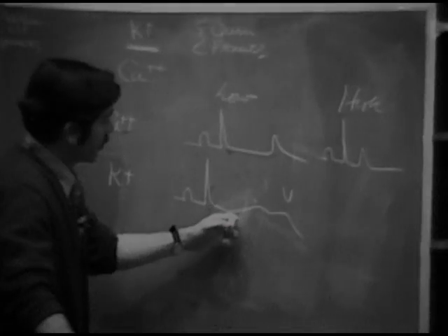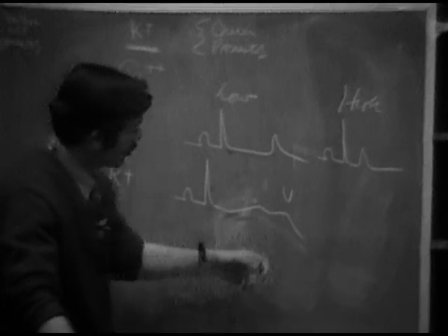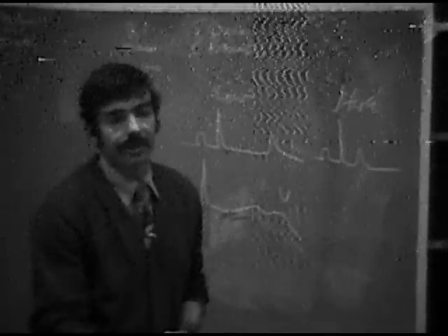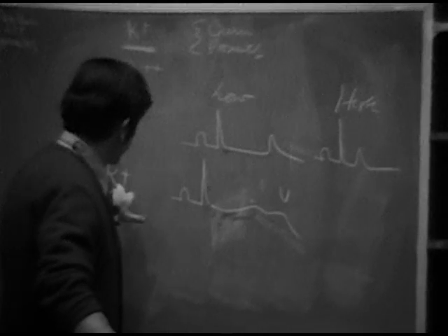I consider it very important to be able to pick this up on the electrocardiogram. This is quite sensitive and should lead you to some definitive therapy, which in some cases can save someone's life. I think that the recognition of hypokalemia is extremely important. Now the effects of quinidine and procainamide look very much like the effects of potassium.